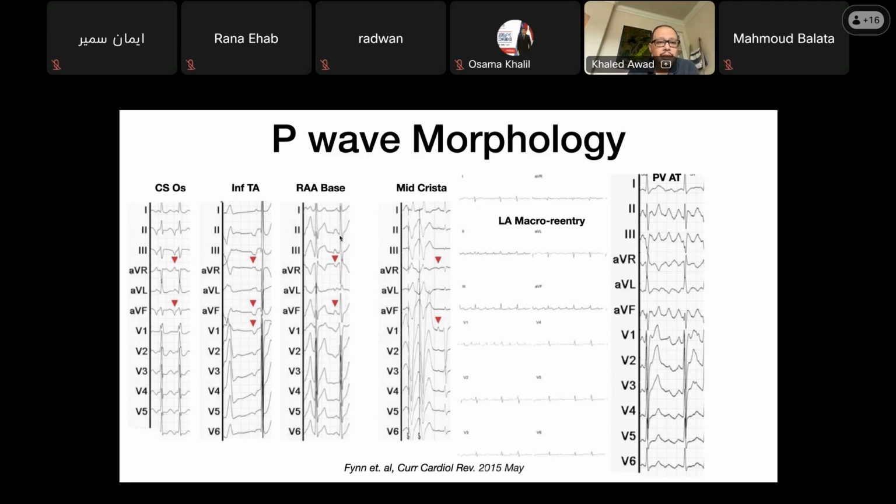Now, look at this one. This is inferiorly directed. Okay, and I didn't sit down and memorize all of these. I'm just going through it with you guys because I want you to think through it just the way I think through it too. You can see two things. It's inferiorly directed, that's number 1. 2 and 3 are positive. And at the same time, you see a transition. So negative, negative, flat, positive, positive, positive. Transitions in the precordial leads, generally speaking, imply right atrium.